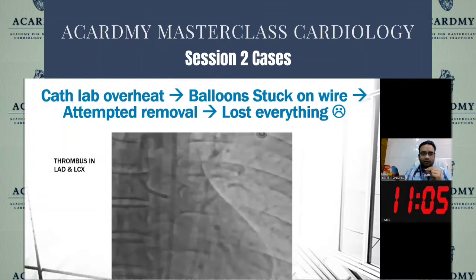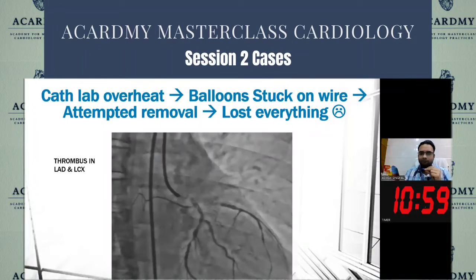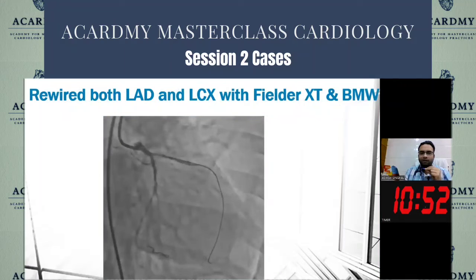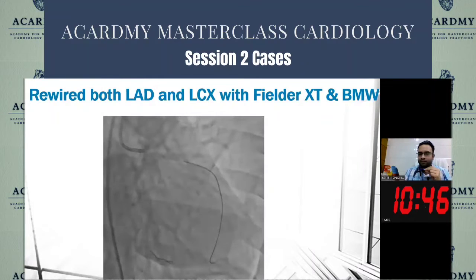After that, we took a check shot when the cath lab resumed its function after the heat passed. We saw there was flow in both vessels. However, there was some thrombus formation, particularly in the LAD. Even though there was some dropping of the blood pressure, we gave inotropic support of noradrenaline. After that, we immediately rewired both vessels, the LAD with a Fielder XT and the circumflex with a BMW wire.